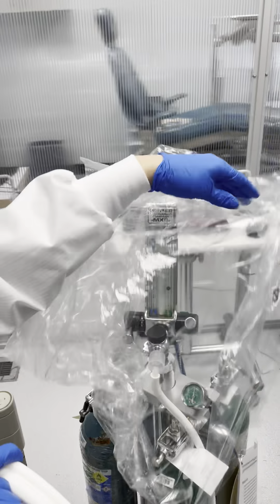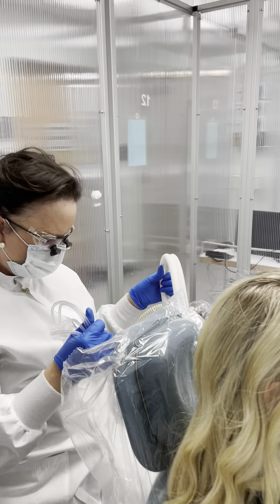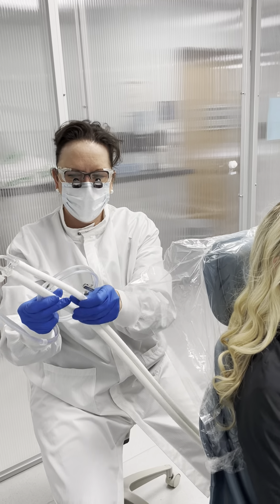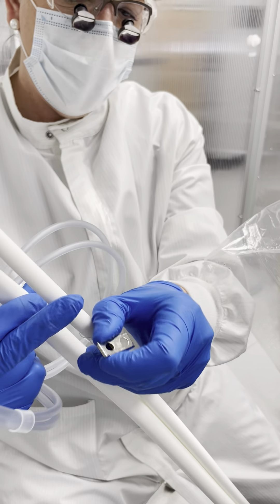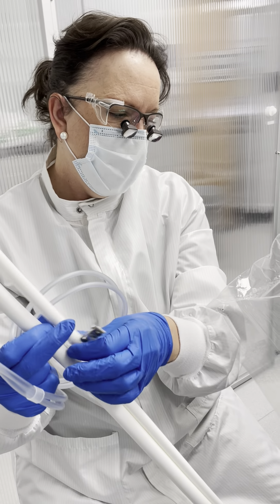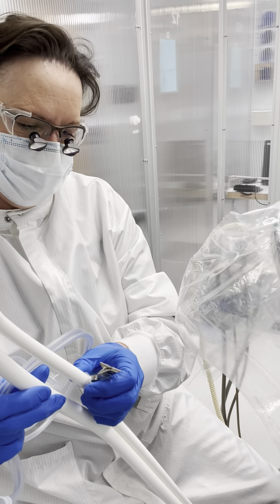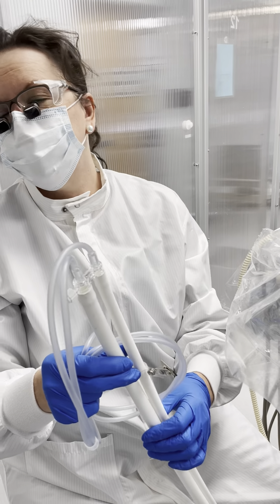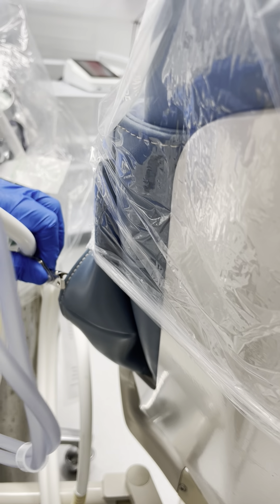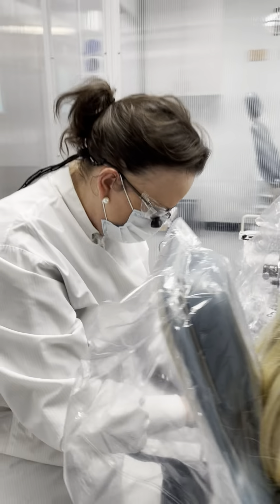You don't want to put this mask on the patient without any gas, otherwise she'll try to breathe and nothing will come through. There's a little clip on the tubing — this clip should remain on the smaller tube, and we usually clip it to the plastic or the side of the chair. It helps prevent the connection between the nasal mask and the tubing from coming apart should the patient suddenly move.